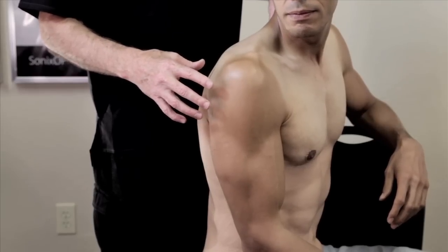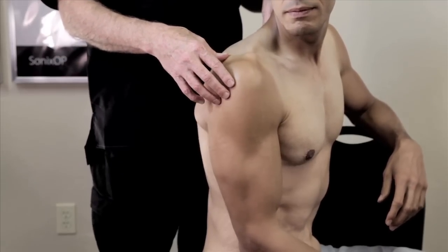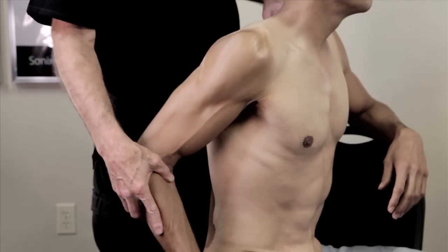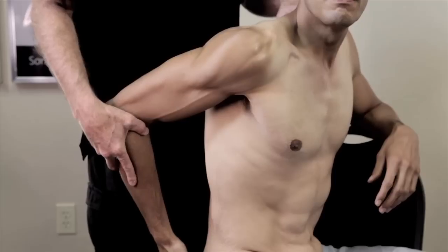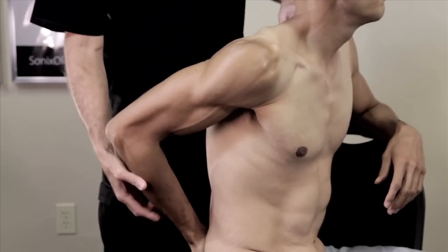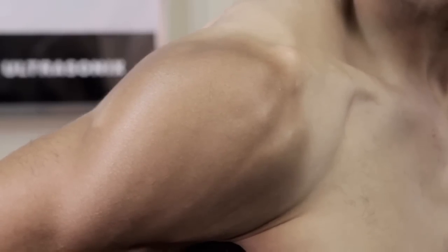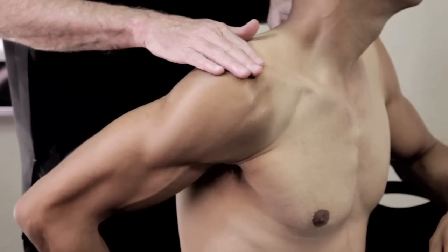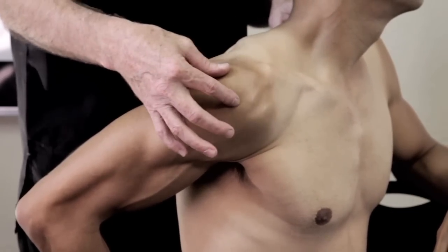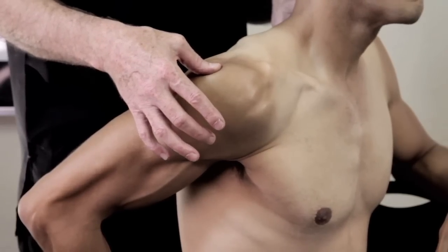The proper position for anterior rotator cuff imaging is the modified crass position. We're going to bring the patient's elbow back in extension with a slight internal rotation, and place their hand on their backside with the palm facing forward. This position brings the supraspinatus tendon anterior, out from under the cover of the acromion, and also puts tension on that tendon, which allows us to pick up on smaller abnormalities.